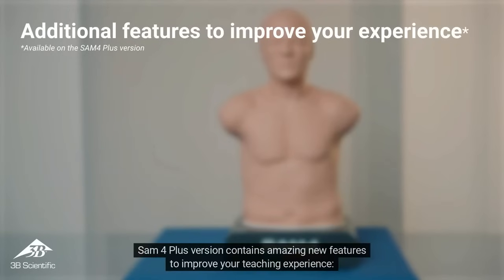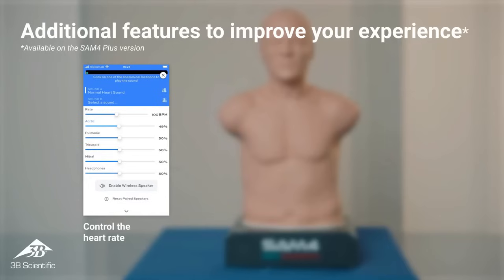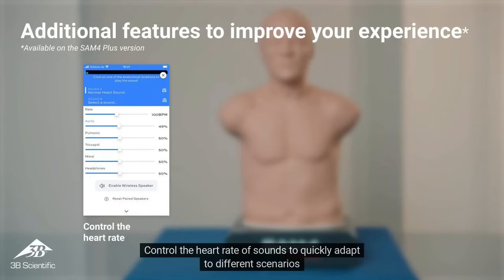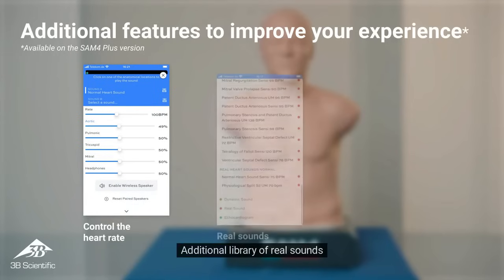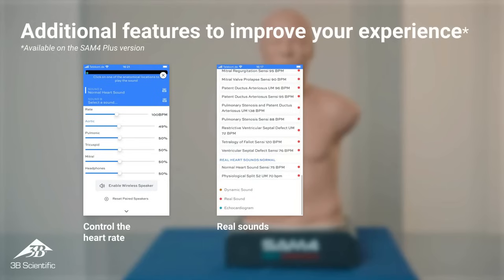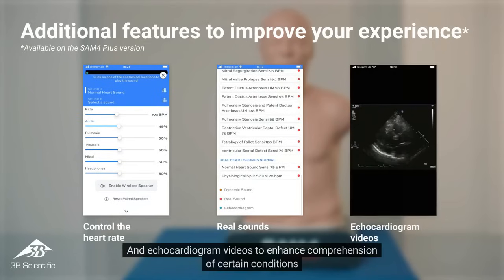The SAM-4 Plus version contains amazing new features to improve your teaching experience. Control the heart rate of sounds to quickly adapt to different scenarios. An additional library of real sounds, and echocardiogram videos to enhance comprehension of certain conditions.